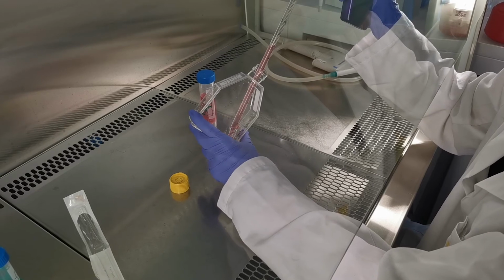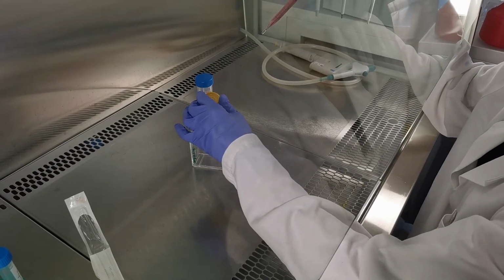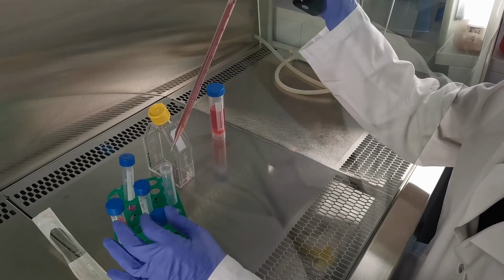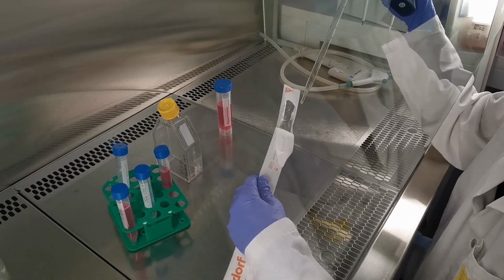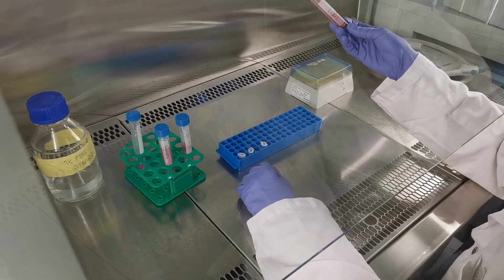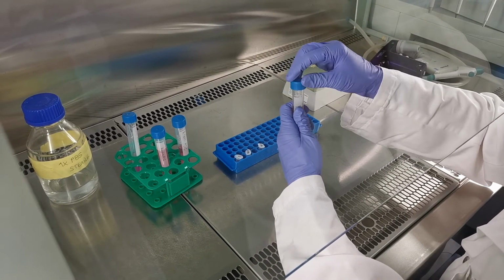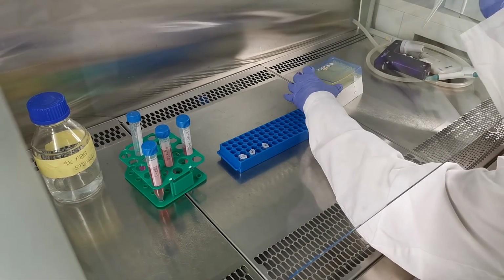Once the cell suspension has been collected, it is transferred to a sterile 15 ml falcon so that the cells can be stored and used later. The same procedure is performed for both the HepaRG and the stellate cells. Now that all cell suspensions are prepared, 20 microliters of each one will be pipetted into 3 different 1.5 milliliter Eppendorf tubes.